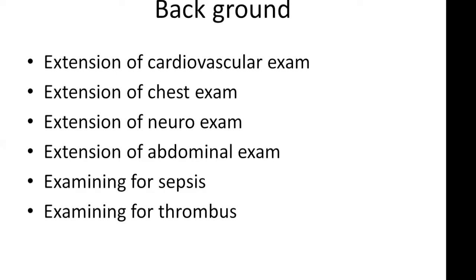Ultrasound is excellent at examining the viscera and can examine the bowel. And in patients with sepsis, if you're looking for the source of sepsis, ultrasound can look into the abdomen and pelvis or any areas where you suspect there is pain in muscles, joints, and soft tissue. And ultrasound is also extremely useful in patients with lower limb swelling or upper limb swelling, in which you suspect the diagnosis of thrombus.